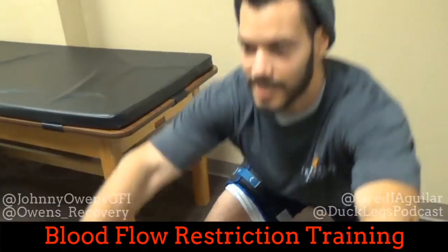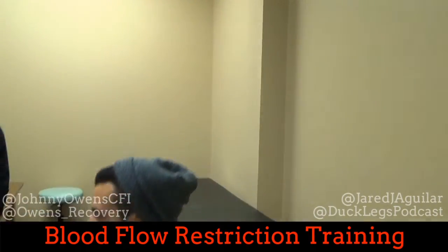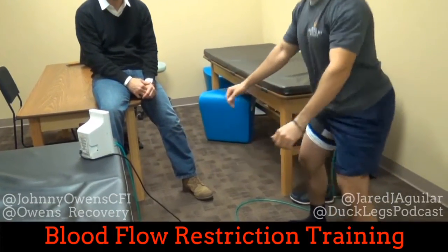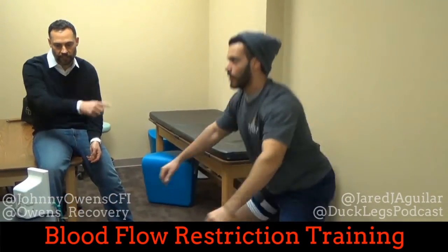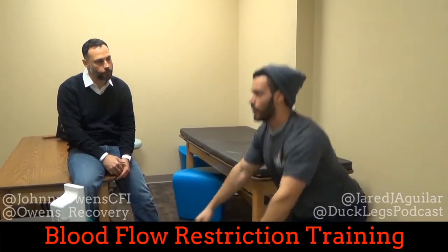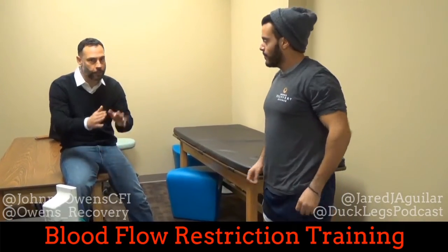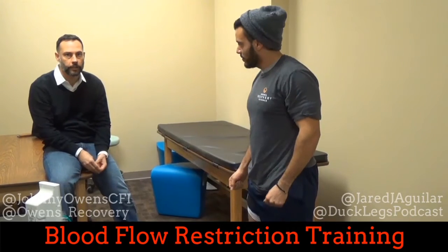Last 15. The machine is constantly monitoring and changing the pressure, maintaining that 80% limb occlusion pressure reading. A tourniquet system should monitor itself and make sure the pressure it's putting out is the pressure it's truly putting out. We have a study going on in the UK looking at different devices — some non-medical devices have pressures that are through the roof and all over the place, which can cause a pressure gradient and the nerve damage that people fear from tourniquets.